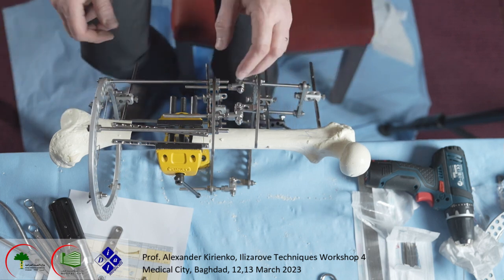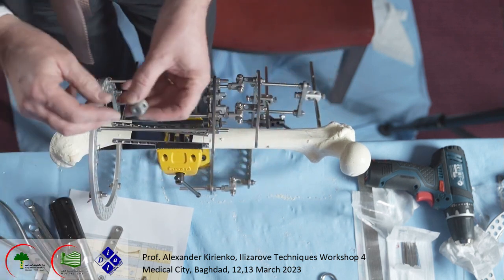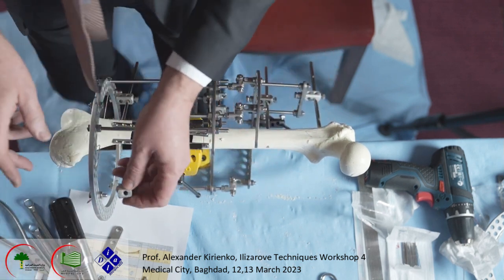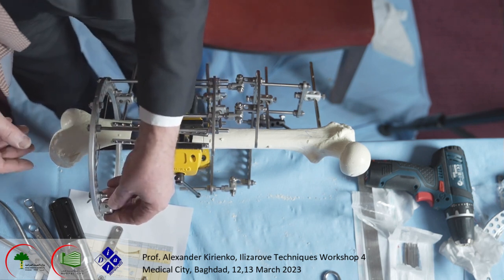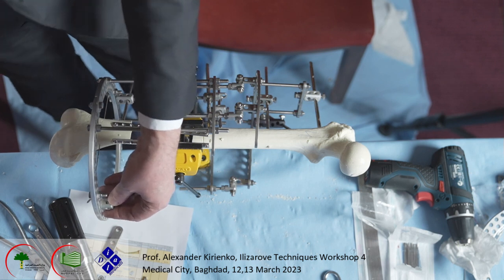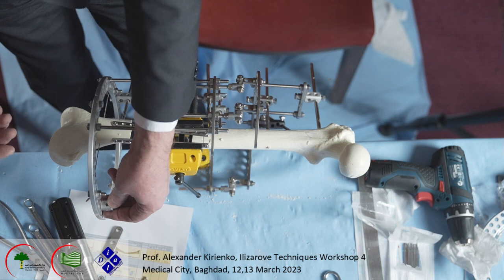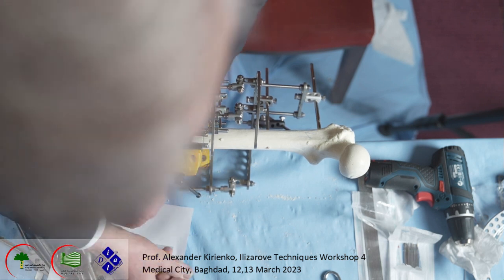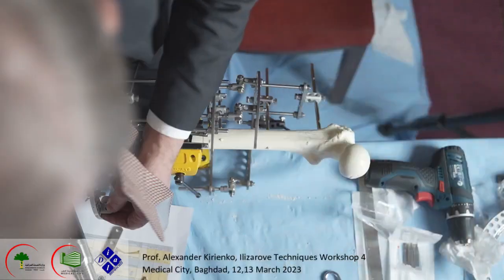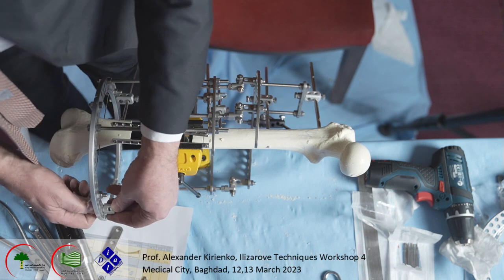Okay? After that, we move to the medial part. Here we use a small bolt again, and this half pin, small. Oh, maybe it's okay here. Yeah. Oh, here is okay.